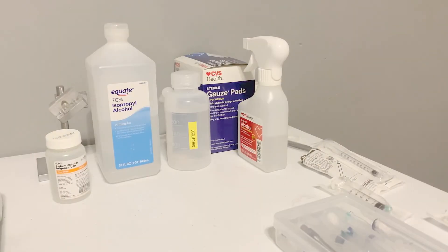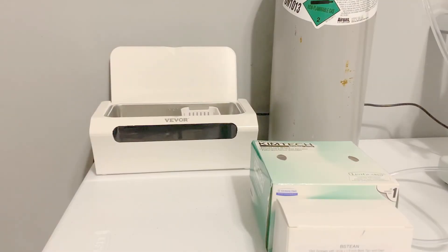You also need 70% isopropyl alcohol, distilled water, and sterile saline solution. These liquids are used to sterilize your equipment and syringes. I also keep an assortment of sterile syringes on hand for use in administering these liquids. Finally, an ultrasonic cleaner is handy for cleaning your syringe tips and capillary tubes.